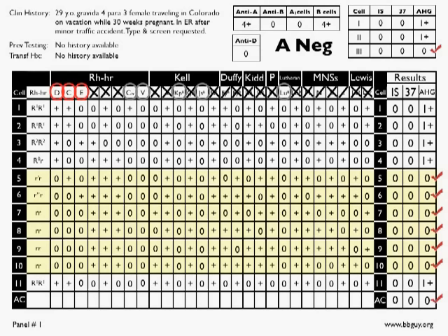So I'm going to focus on the ones that are high yield, in this particular case, big D, big C, and big E. And most of you are already at the point where you know what this panel is, and that's totally fine, but let's just take you through the thought process. So again, the next step is we look at what is there. In other words, let's look at the cells that are reacting and see if we can find one antibody specificity that accounts for all of them. So in this case, let's look at the possibilities.